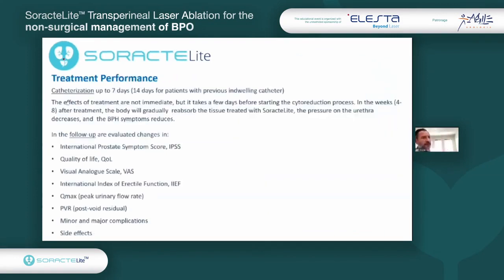As regards the treatment performance, the catheterization is up to 7 days. It depends on patient characteristics and on the prostatic gland. So I cannot give you just an exact number of days to keep the catheter in place, because, for example, patients who come to us with an indwelling catheter may need at least 14 days before they are able to remove the catheter.